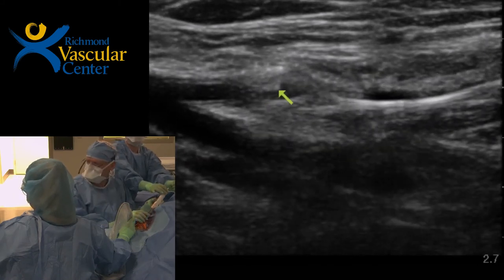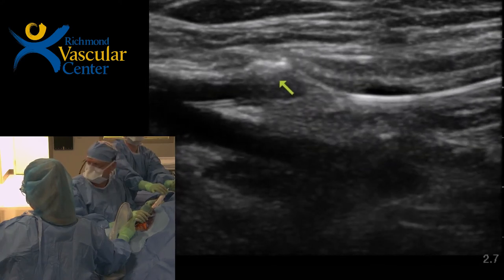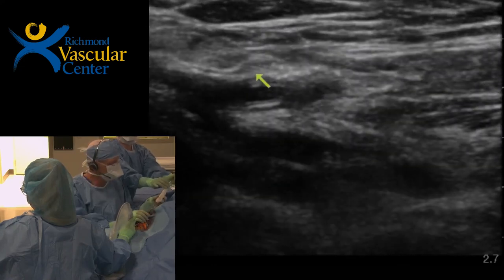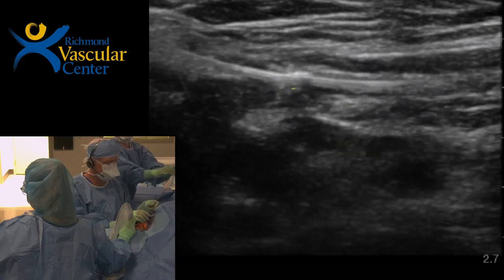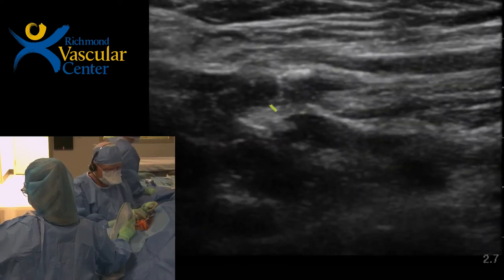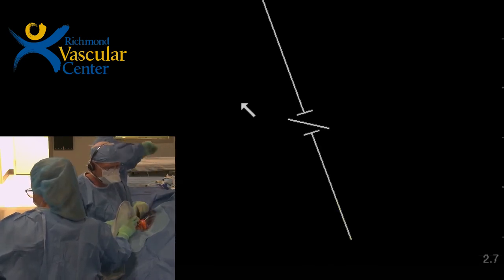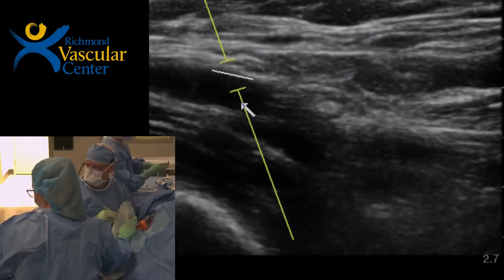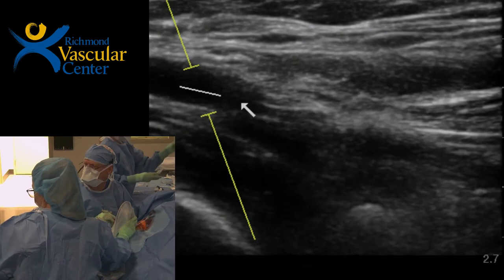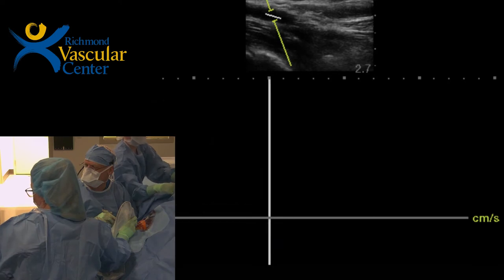All right, hang on a second. 1 second. All right, let's do the removal pulse. Okay, it's out. Let's answer that question. So the 0.1 just tells you how much tissue you have between the jaws. And so if you have too much, maybe you haven't crossed in the right spot. And I've taken the tourniquet off, and we're going to get a waveform here. And if you have too little, maybe you just closed the device on itself and didn't capture anything.